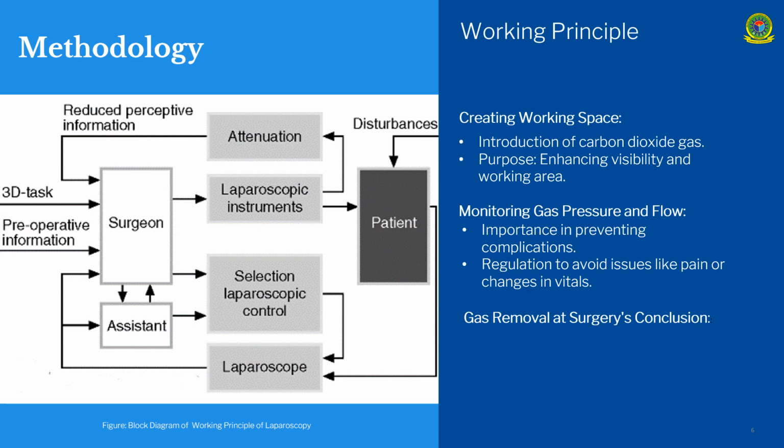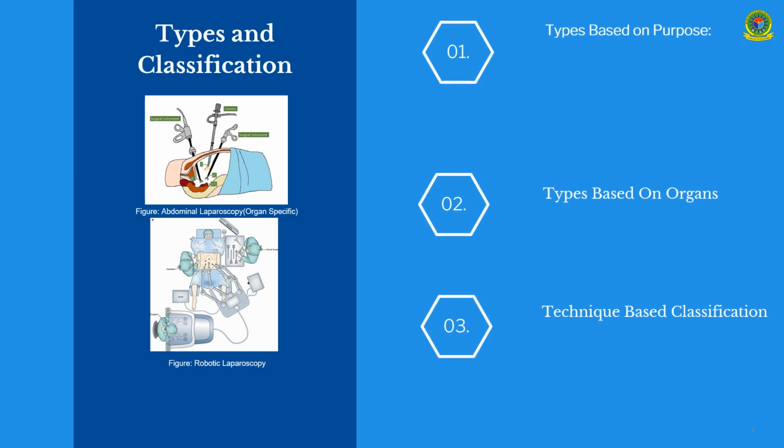Monitoring gas pressure and flow is also important here because it prevents other complications. It requires regulation to avoid issues like pain or changes in vitals. Gas removal at the surgery's conclusion is also important because it ensures patient comfort and prevents post-operative complications.